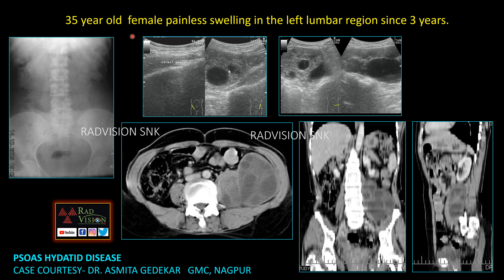Next case: a 35-year-old female with painless swelling in the left lumbar region for 3 years. On the erect abdomen radiograph, the right psoas shadow is clearly seen but the left psoas shadow is not seen. On CT, the normal right psoas muscle is seen but there is a cystic lesion with multiple daughter cysts noted within the left psoas muscle. This is a case of hydatid cyst in the left psoas muscle. Thanks to Dr. Asmita Gadekar for contributing this case.